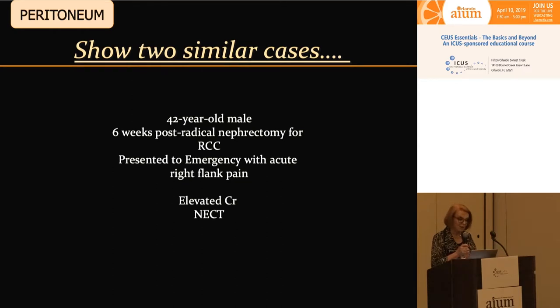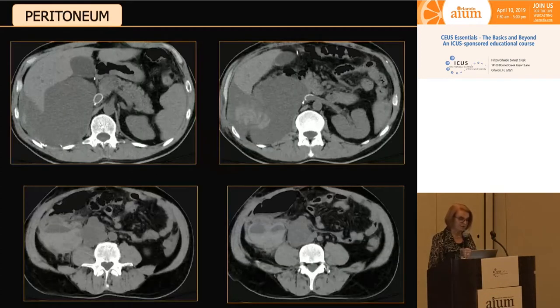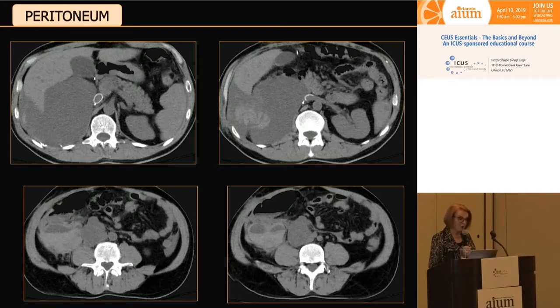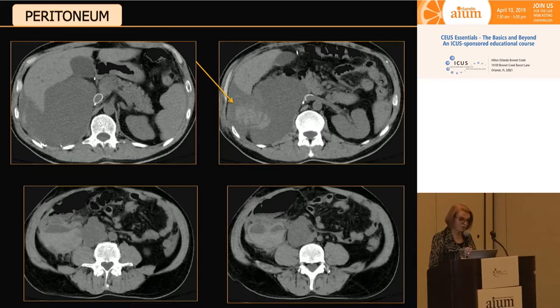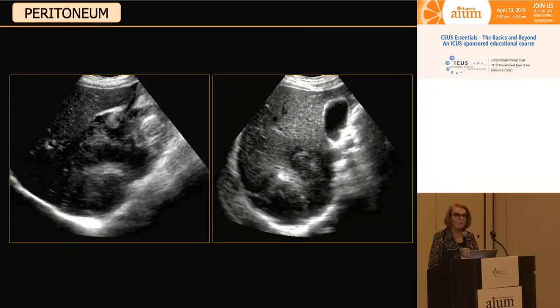Now I'll show you two similar cases. The first is a 42-year-old male who was six weeks post-radical nephrectomy for renal cell carcinoma. He had an aggressive renal cell carcinoma necessitating removal of his entire kidney. He presented to the emergency with acute right flank pain and elevated creatinine, and had an unenhanced CT scan. His left kidney is present; his right kidney is the one removed. There's a very large fluid collection filling his entire right flank.